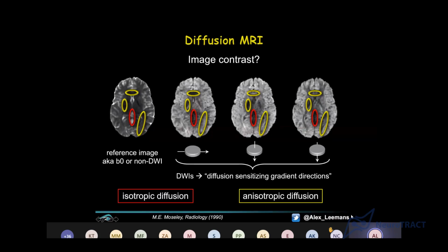So that's take-home message one. Diffusion along a pathway gives a low signal in the image, and diffusion perpendicular to main pathways gives a high signal. Okay? This is anisotropic diffusion, right? Because there's a clear preferred orientation in which molecules are moving around.